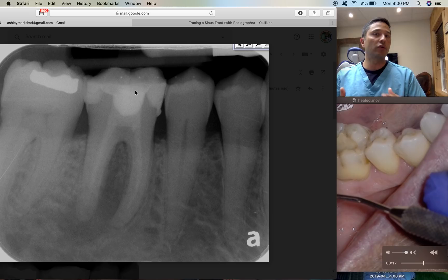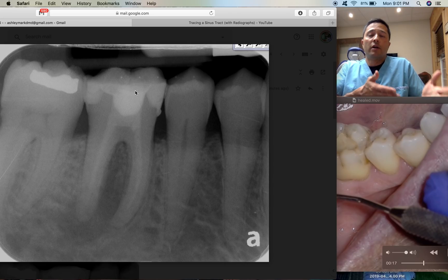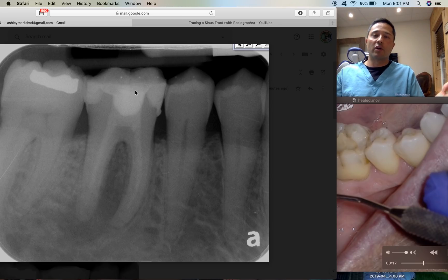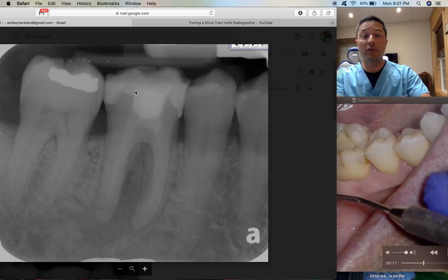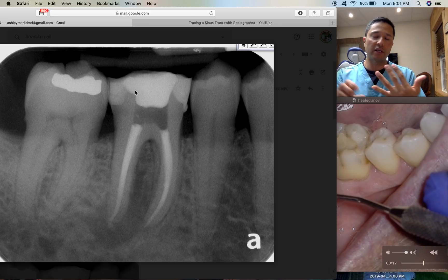Everyone has a different article they can reference about the ultimate time for calcium hydroxide — you need to consider things like making the tooth more brittle. The patient sat for four weeks, came back, the sinus tract is healed, and you can see a little bit of resolution. I went ahead and obturated because the sinus tract was healed and I was able to adequately dry the canals.